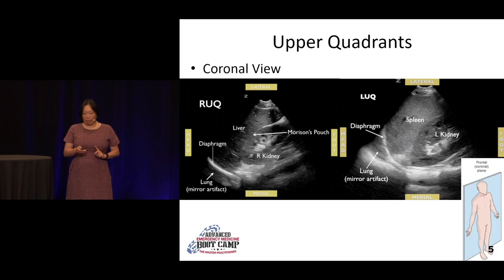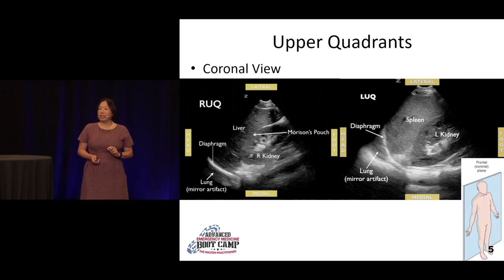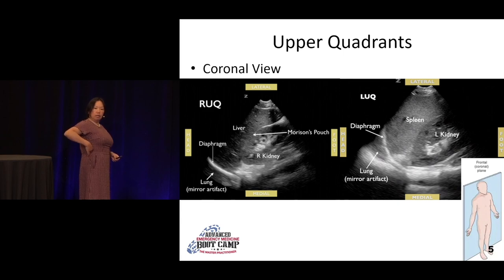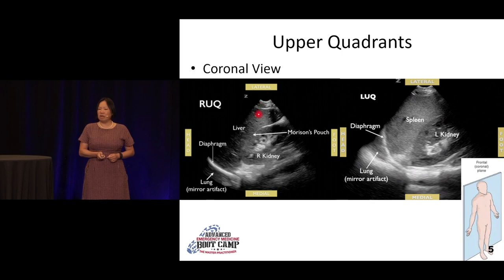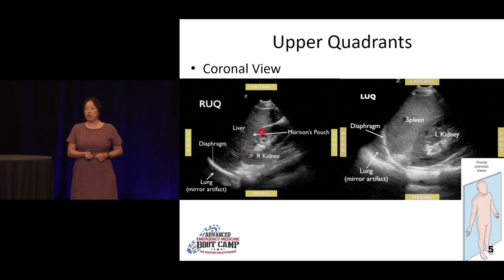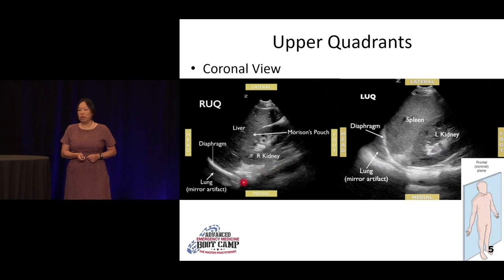Let's take it one picture at a time and look at the right upper quadrant where there's liver and kidney. Remember that small line on top right by the lateral edge of the body? That's the first thing you see, so it's on top. First thing you see is skin, subcutaneous tissue. Then you come across this bright white line — that's the peritoneum — so after this you've entered the belly. The first thing you hit underneath the peritoneal stripe is the liver. Then as you look medially, your eye gazes into the kidney, and then here's your psoas muscle before you hit the spine.